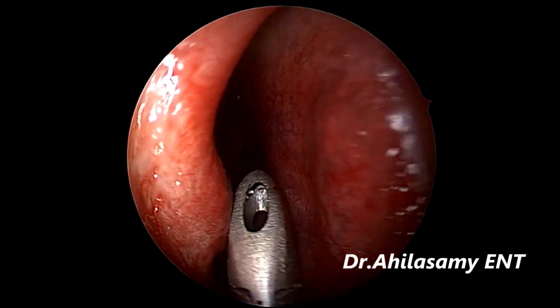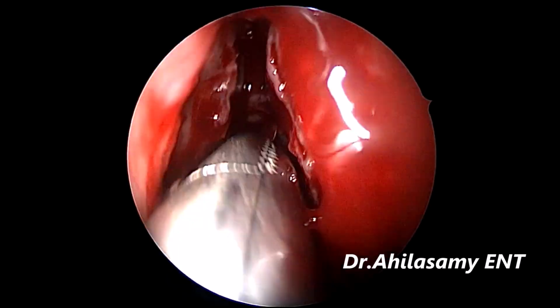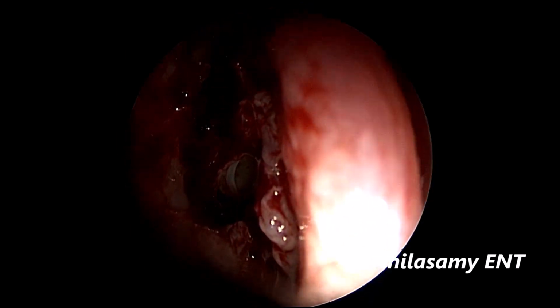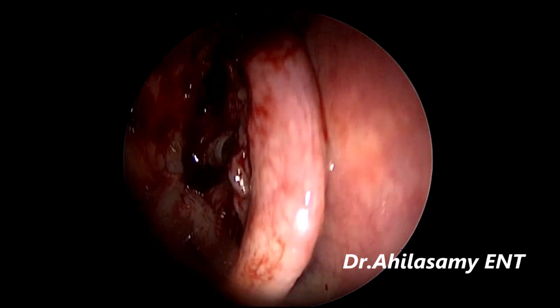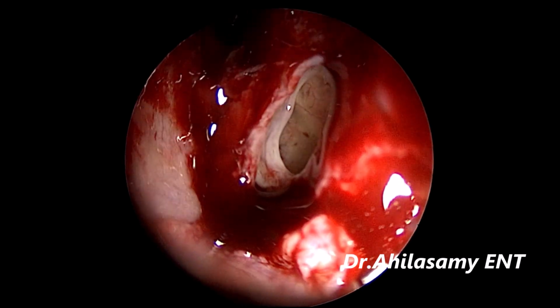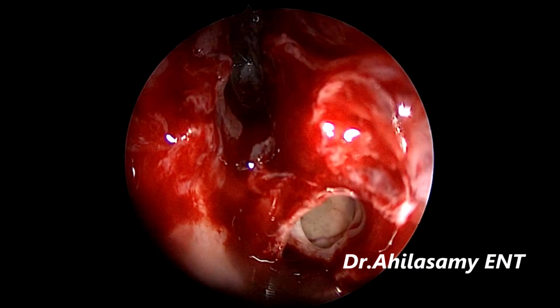Suppose there is not much disease. These patients are treated pre-operatively with 1 week of oral prednisolone. So the disease subsides, minimal disease. So I have the concept of one cell behind. That means I stop after the disease. If the one cell behind is good, I stop with that.